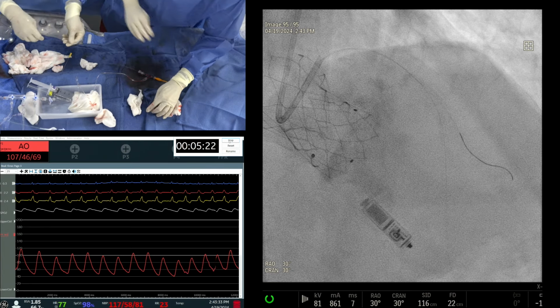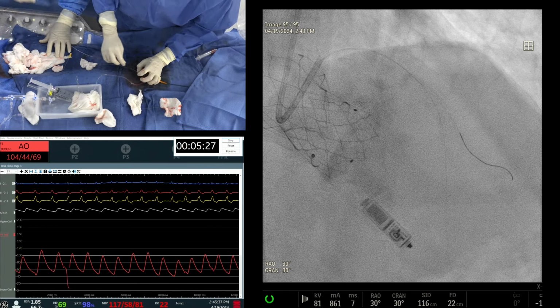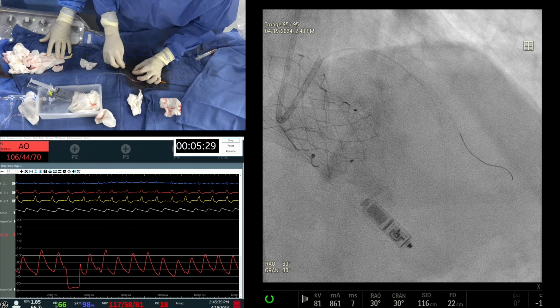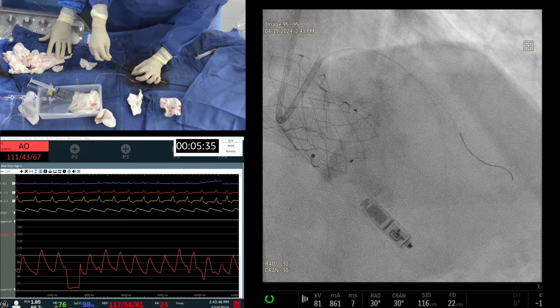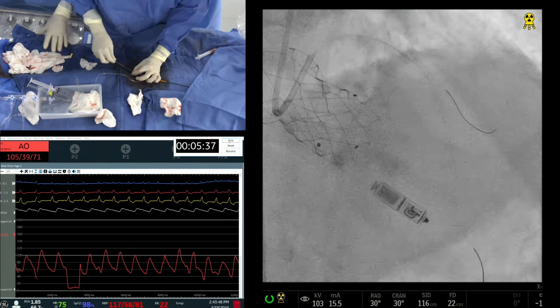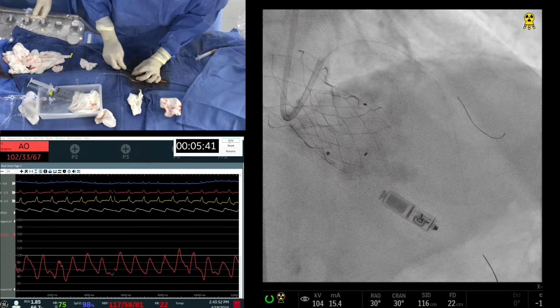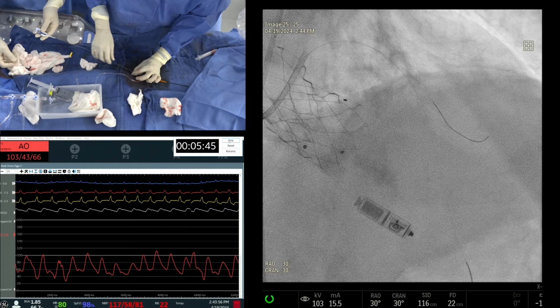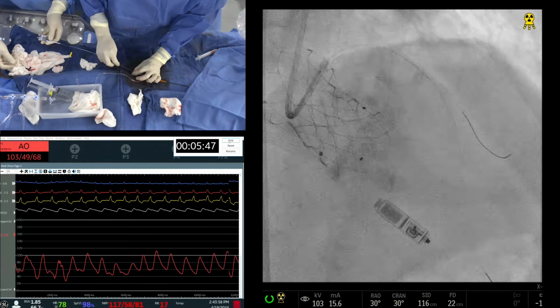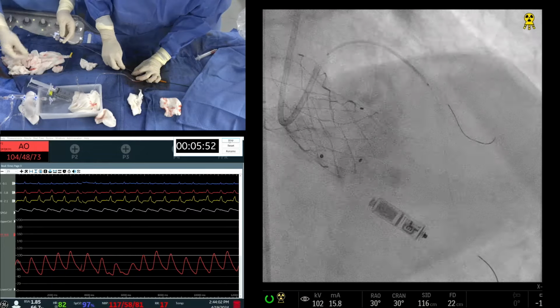What might help you, it's a 3.5 proximal vessel. So if he's going to put a 3.0 by 48 in, maybe 3.5 at 15 high pressure. What about just using 20? Okay. I agree with that. Sometimes I think the stenting is not what jails the branch, it's the post dilation. So I think a lot of times if you can recross with another wire after the 3.0 stent, it will improve the chances of patency. Good point.